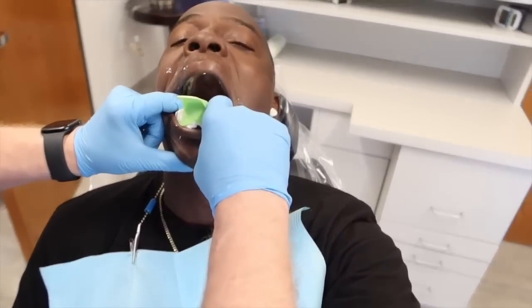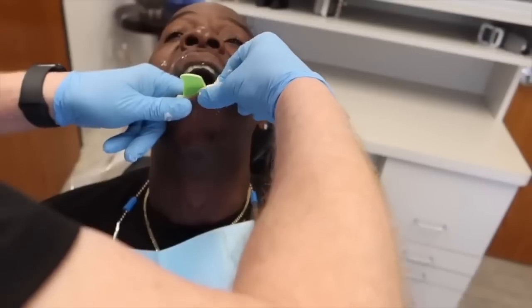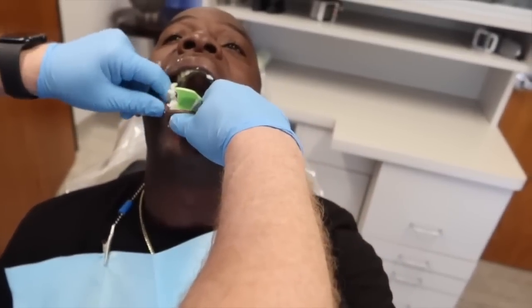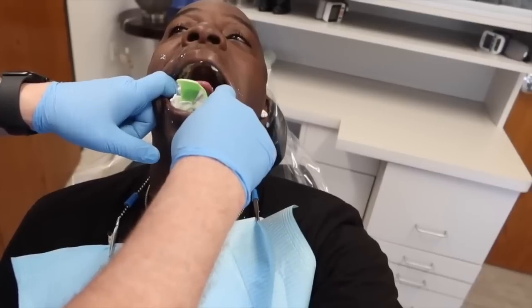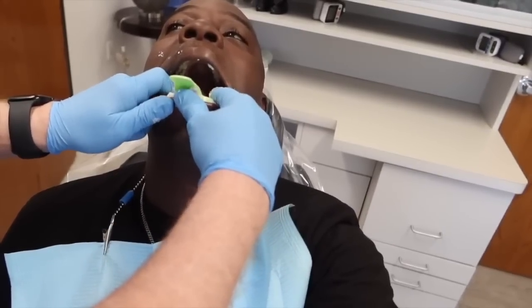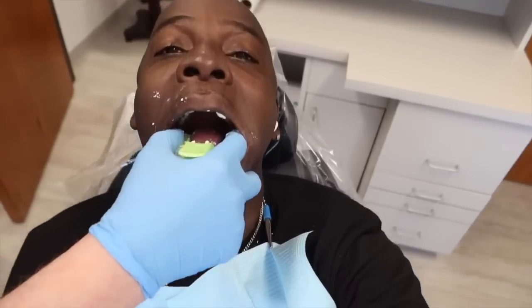So he's gonna come back and he's gonna do the bottom mold of my teeth to get the impressions. Push it for me. Open wide for me. This is the lower one. Center it, place it, push it down. Move your lips a little bit. Close a little bit. Can you raise your tongue up for me? Stick it out for me. Left, right. Super. Let it go. Two more minutes, sir. You okay?